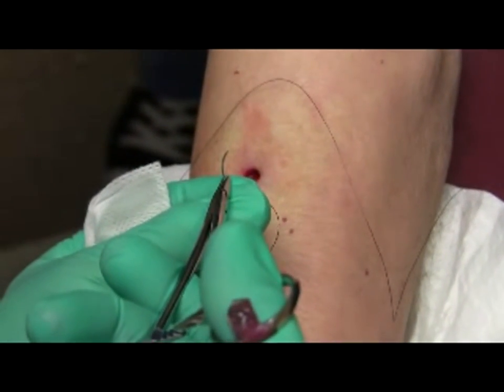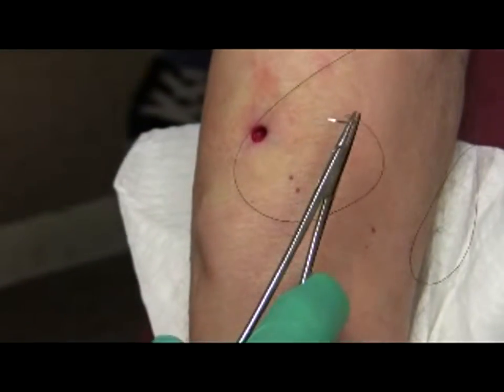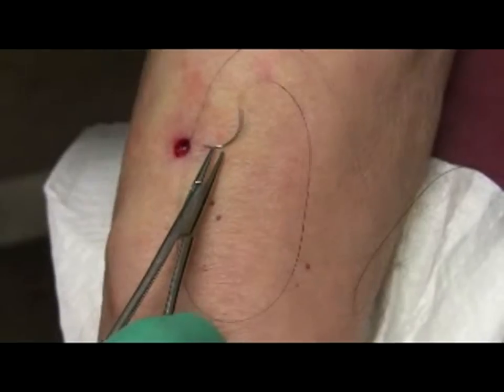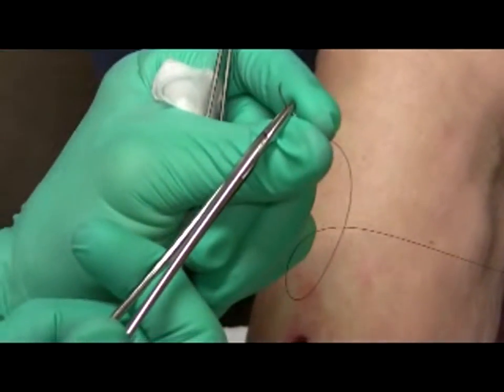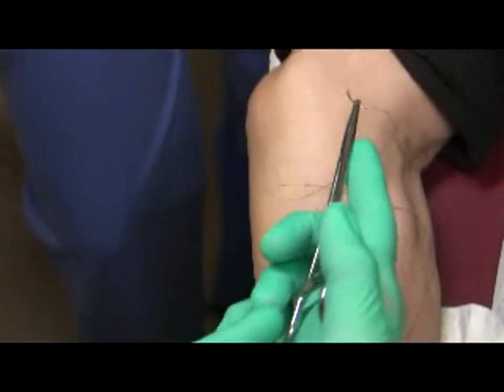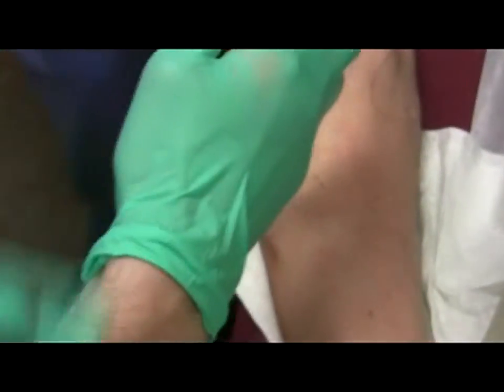First things first: I grab the needle — listen for the click. Two clicks is good because you know it's really clamped down. If you try to put a suture and it's not clamped down, the needle can slip and you lose control. Some surgeons say to hold the needle driver in the palm, where the needle driver is flush with the palm and your index finger guides the needle, with the wrist completely flush with the arm. If you twist your arm — pronate and supinate — the needle goes a certain way.